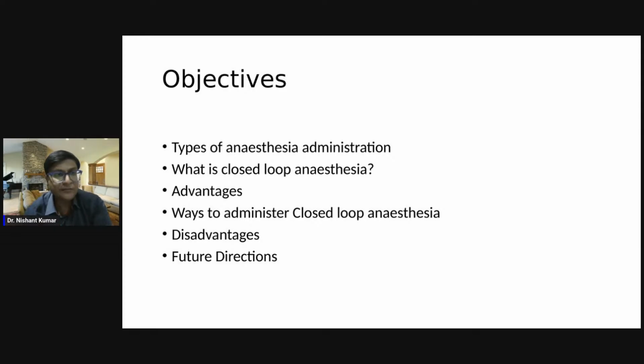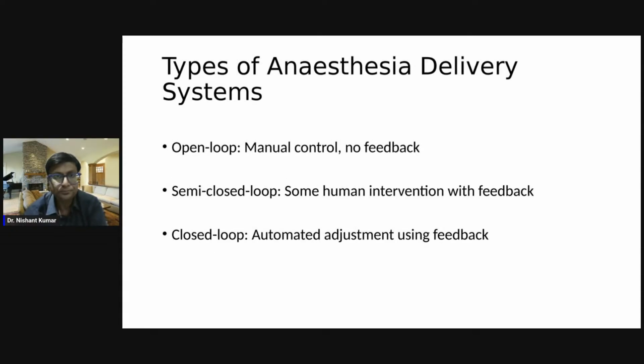The objectives of today's talk would be: what are the different types of anesthesia administration? What is closed loop anesthesia? What are its advantages? How can we administer closed loop anesthesia? What are its disadvantages? And what does the future hold? And what are the future research possibilities that this technique offers?